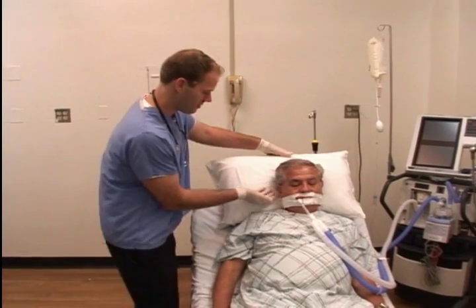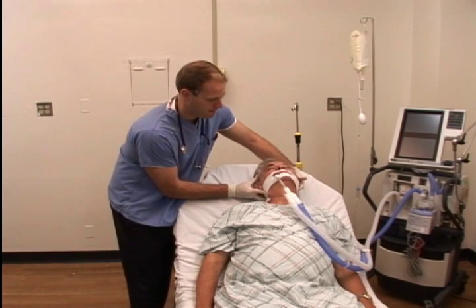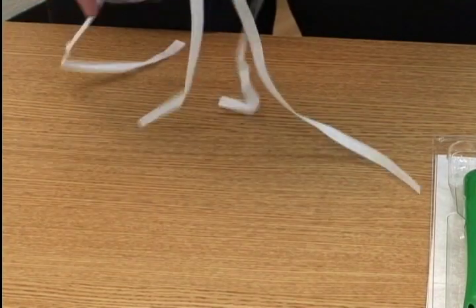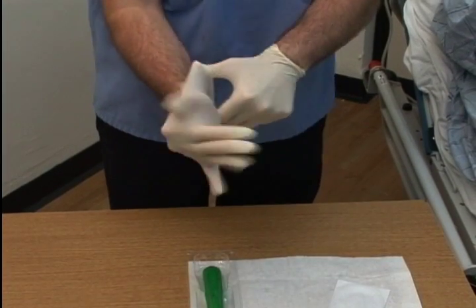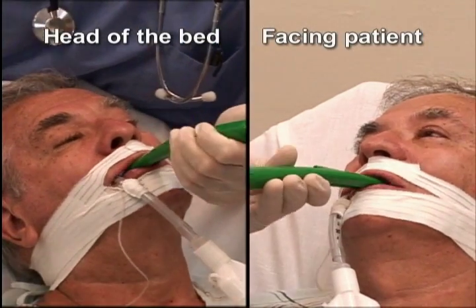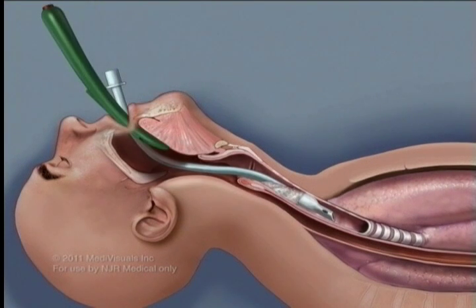If your patient's condition is deemed appropriate, remove your patient's pillow and tilt the head back to facilitate opening of the airway. Put on your gloves and a mask with facial shield for your protection. Insert the No-Bite 5 into the patient's mouth. Depress the tongue to facilitate opening of the airway. Turn on the light. Insert the suction catheter into the laryngopharynx area. Suction out secretions.